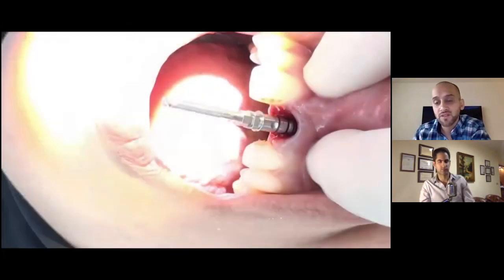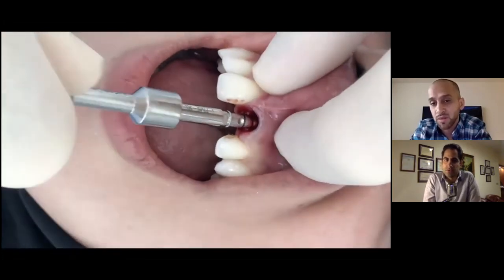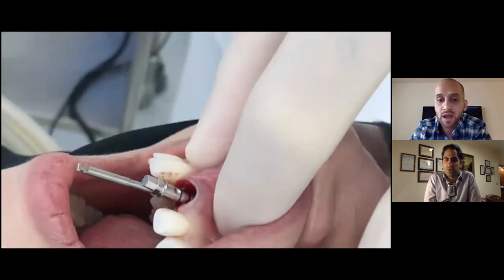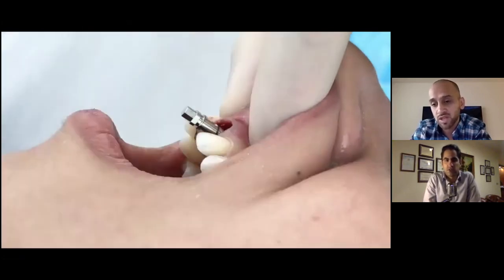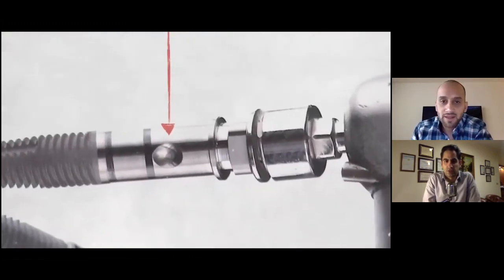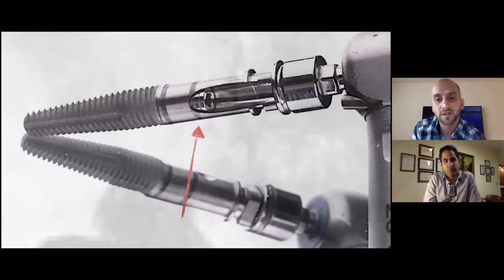One of the biggest benefits of them also is that they do have markers on them. So, you know, it's a very technique sensitive implant. When you're placing this implant, you have to make sure that there's a dimple on the buccal that faces the buccal. There are some lines on the fixture mount. Those lines we will talk about later. They help to make sure that these implants are placed at the right depth. And as you can see, the screw access hole is coming out of the cingulum. And that is very important to be able to achieve screw retention. And this is the dimple that should be facing the buccal, and we'll talk about this in a little bit. And this is the screw access hole, which should be facing the palatal part after implant placement.